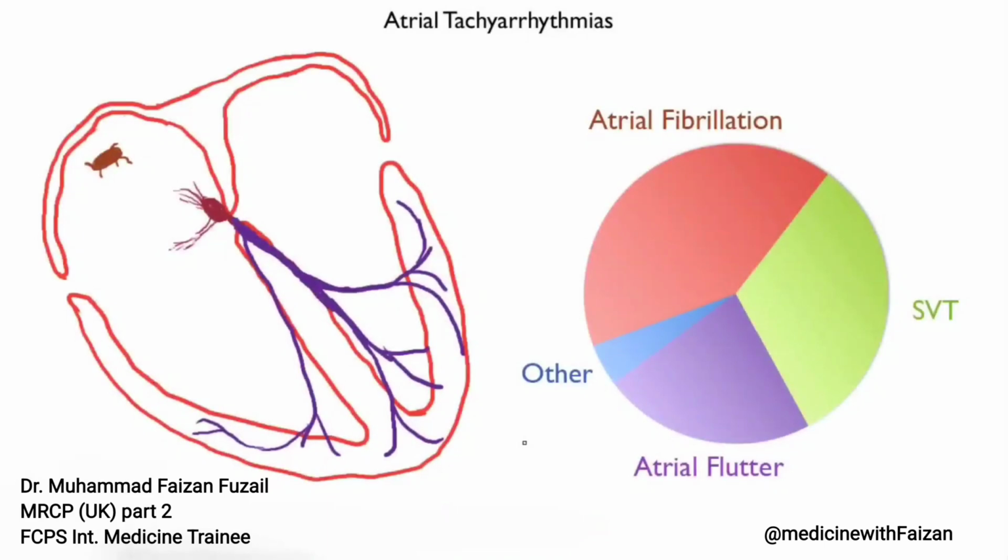In this lecture in our ECG series, we are going to talk about atrial tachycardia and its different types. Atrial tachycardia simply means fast heartbeats coming from the atrial chambers. There is a whole bunch of different kinds of atrial tachycardia. We are going to discuss each and every one of those and try to put things into perspective.